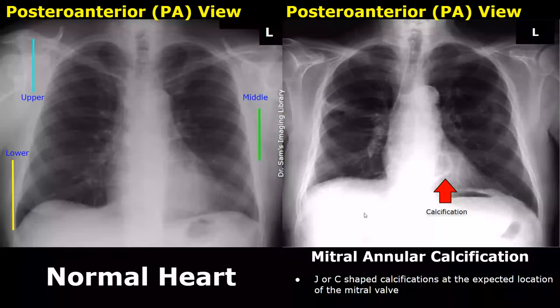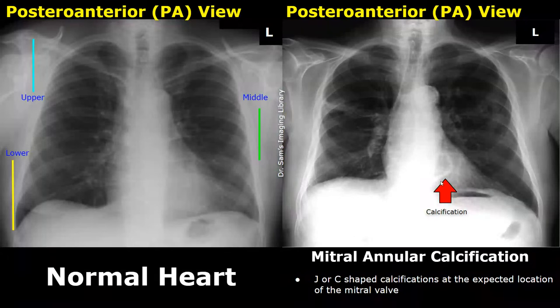Mitral annular calcification can also be seen on a chest X-ray. It usually appears as a J- or C-shaped calcification at the expected location of the mitral valve. The calcification will appear bright or radio-opaque.